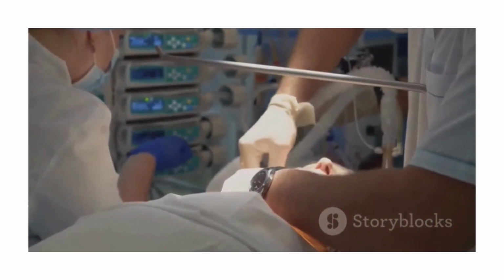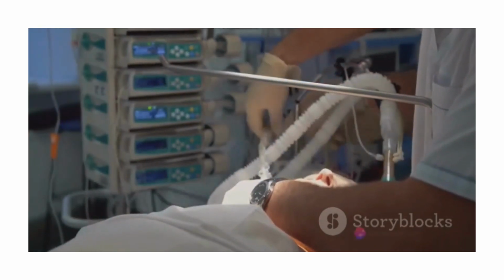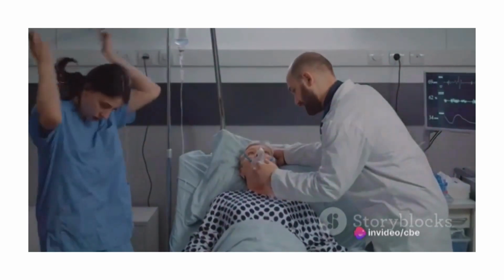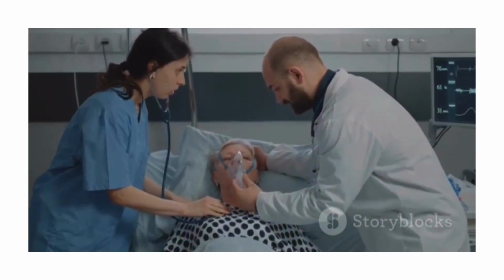Then, the actual process of extubation begins. The cuff of the endotracheal tube is deflated. The patient is asked to take a deep breath, and as they exhale, the tube is gently and swiftly removed. The patient is then encouraged to cough to clear any remaining secretions.